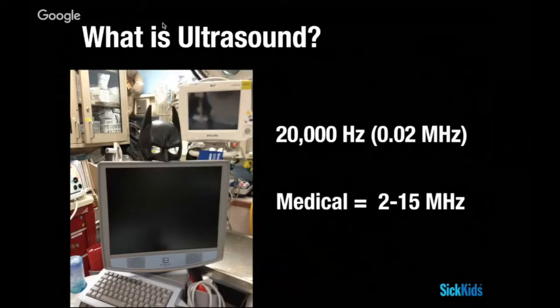Sound is a pressure wave. Your vocal cords, if you're talking about sound in speech, vibrate up and down like a speaker does. They hit molecules within the air. They force those molecules to move outwards, hit other molecules until they reach a transducer, which is someone else's eardrum, and then those molecules cause the eardrum to shake. And in medical ultrasound, you're getting the same effect, but the speaker and the receiver are the same device, the same crystal or membrane within your probe.